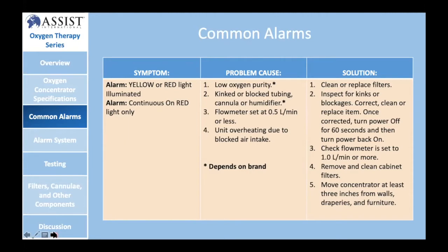We do want to clarify one quick point with all of these alarms. These are based off of our experiences with the Airsep concentrators. And while a lot of the oxygen concentrators have very similar mechanisms and alarms, we encourage that you advise your technical team at your facilities, your engineering maintenance teams, to thoroughly peruse the service manuals, the technical manuals that come with your brand of oxygen concentrators.